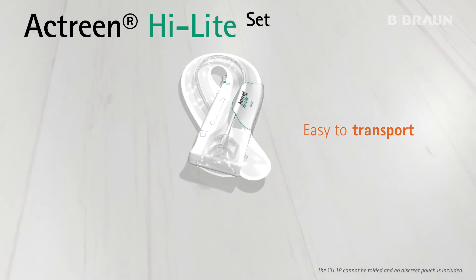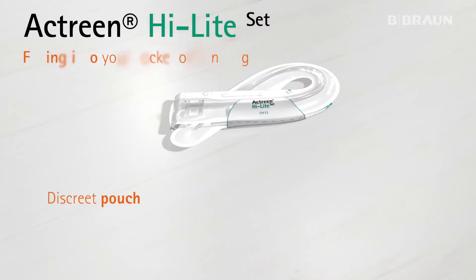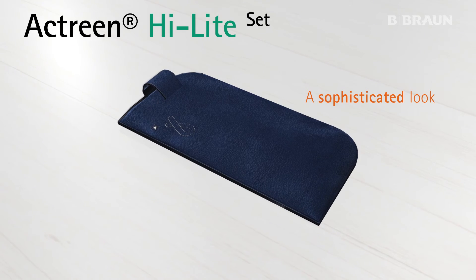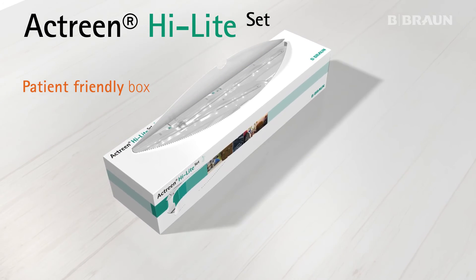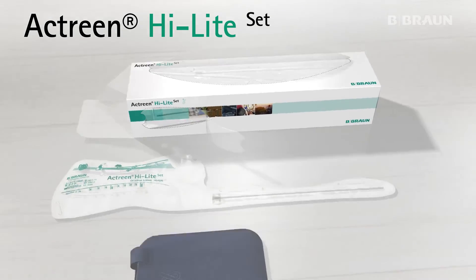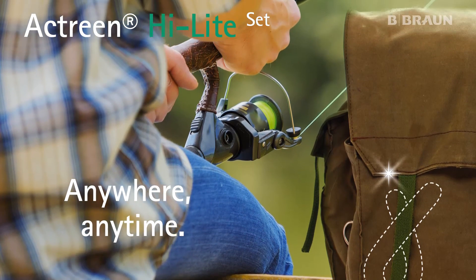Thanks to its foldable shape and lightweight design, the Highlight Set is easy to transport, easily fitting into your pocket or handbag. Its discreet pouch is designed to carry your daily quantity of sets with a sophisticated look. The patient-friendly box has also been designed to give the choice of three openings to suit every patient in their individual surroundings. Actreen Highlight Set is the perfect solution to make your life easier anywhere and anytime.